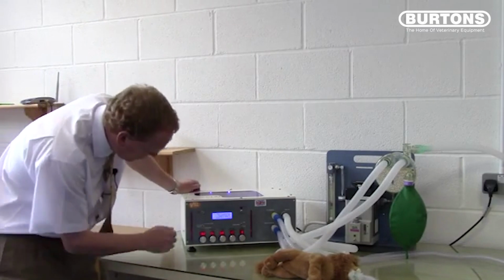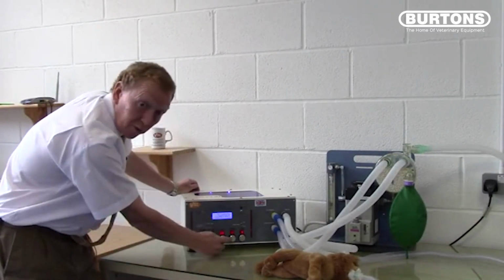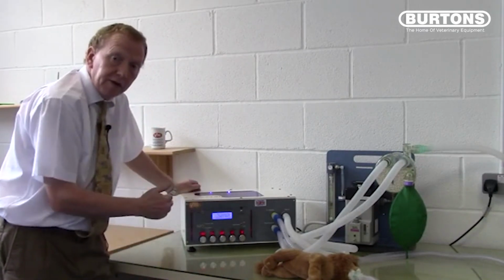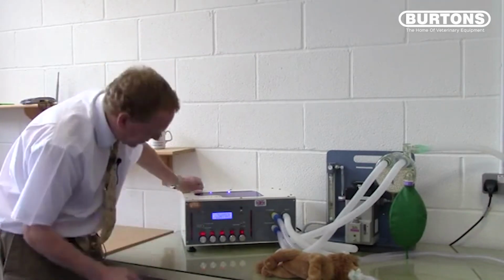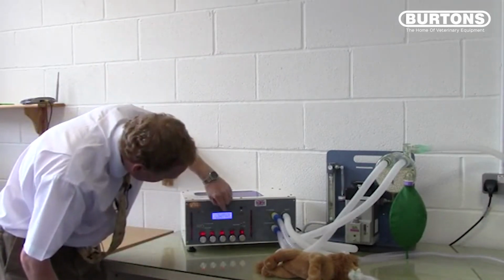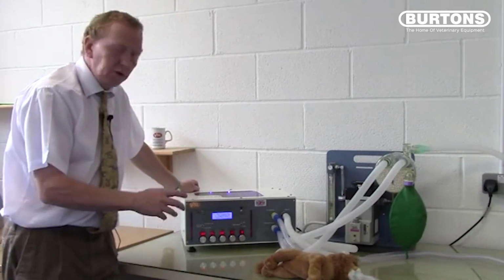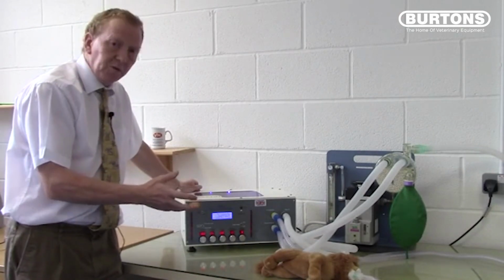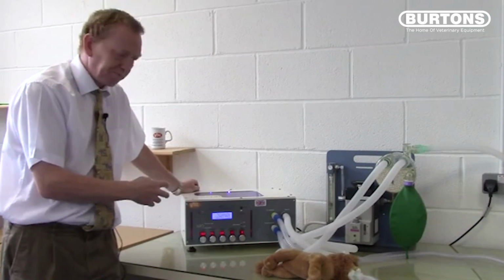And if we look on the screen, we'll confirm that the airway pressure reached is 12, which is what we've set here. In addition, Merlin knows very accurately how much volume has been delivered and can measure it and display it on the screen. And here we see that the tidal volume is 152 mils. So we've achieved exactly the same ventilation performance, pressure cycling, as we did when we were volume cycling.